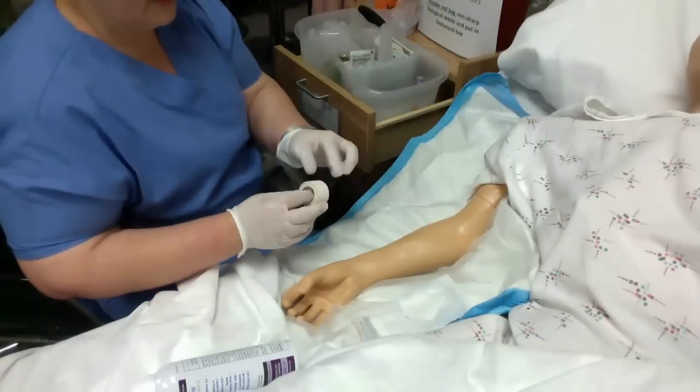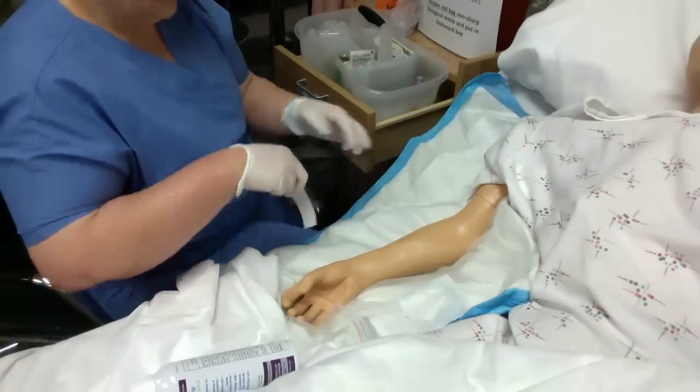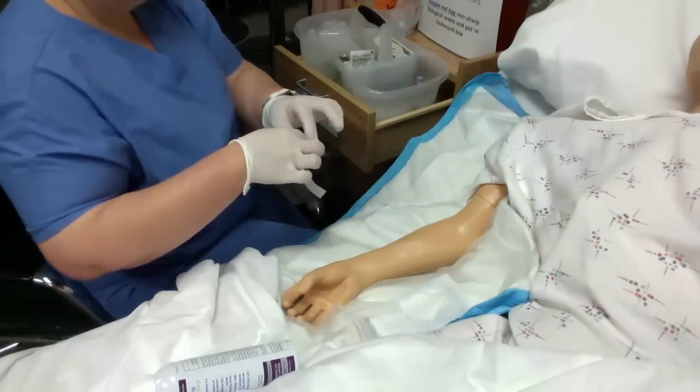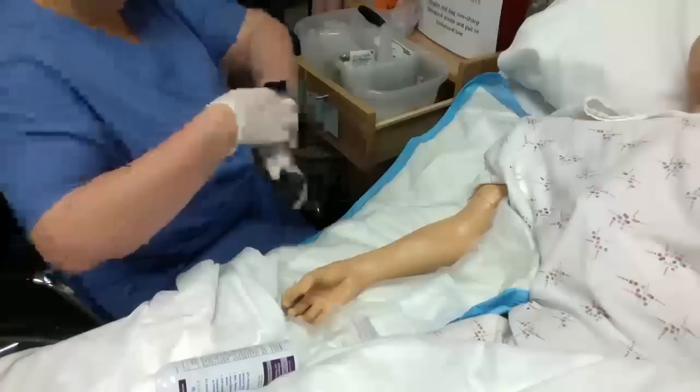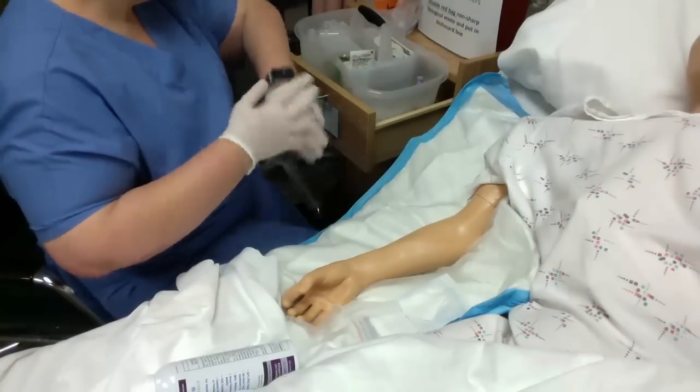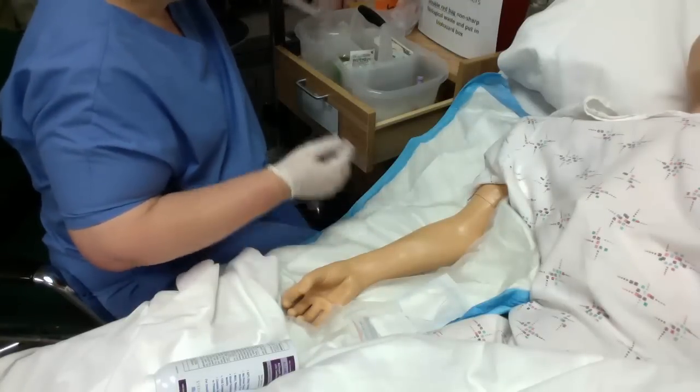Like I said in the podcast, these side rails and bedside tables — other people have been up against them, so make sure that you don't put tape on anything dirty. Since I just donned these gloves, they're clean.